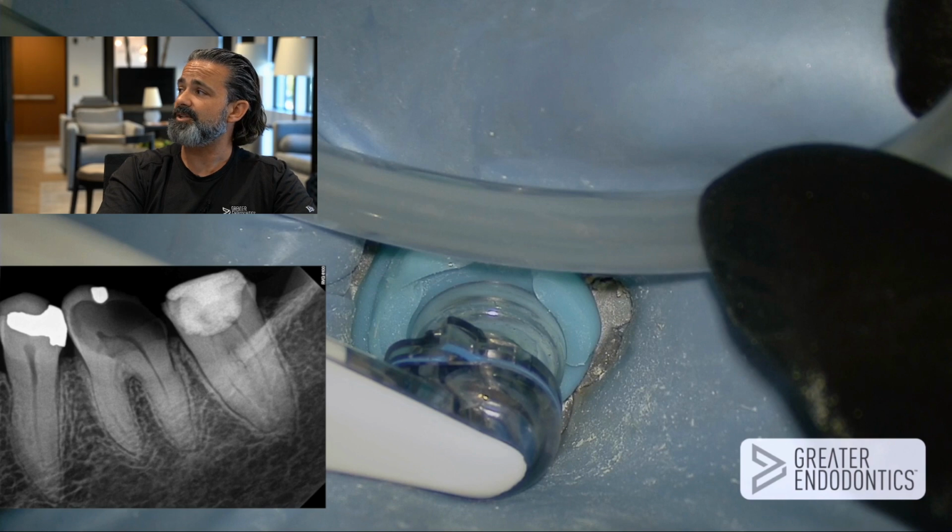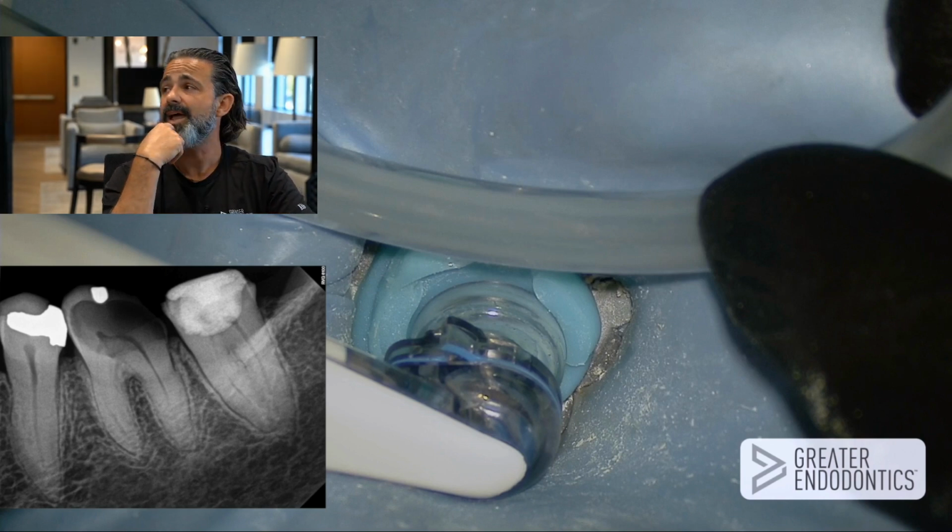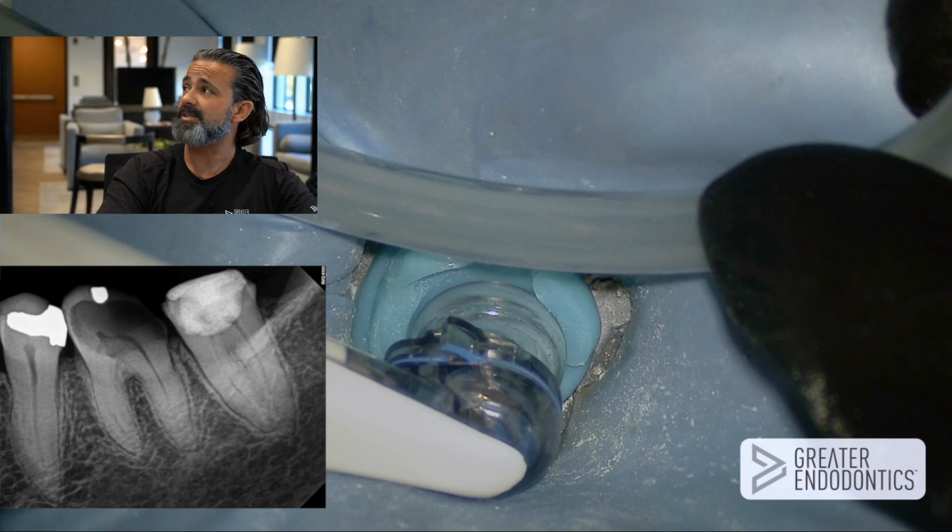But this is pretty much smooth sailing on this tooth. And my blockage roughly is occurring right here where my arrow is. So from here to here, I know I'm in a little bit of trouble of no man's land, and I want to know what that is. And my wing of my prayer is that I'm going to have fluid dynamics, not leave egg on my face, to have an acceptable outcome of this case. So I want this thing perfect.